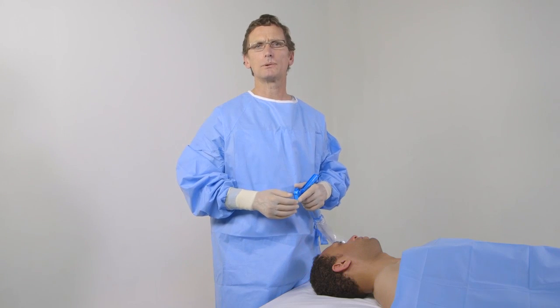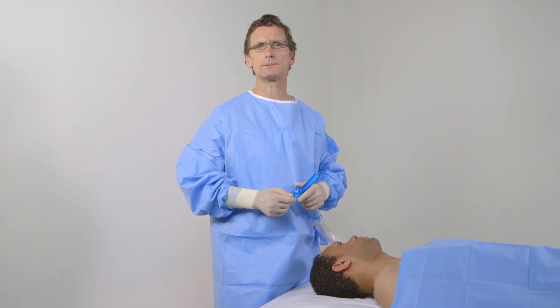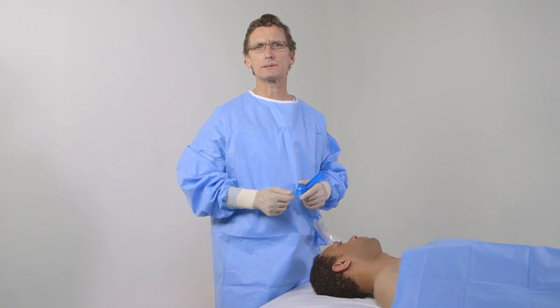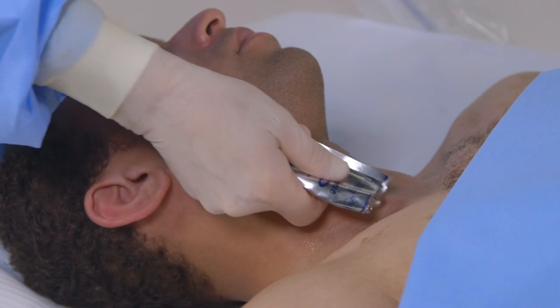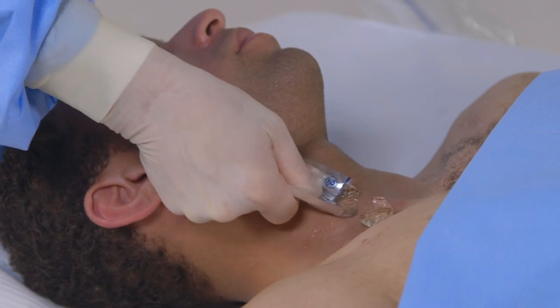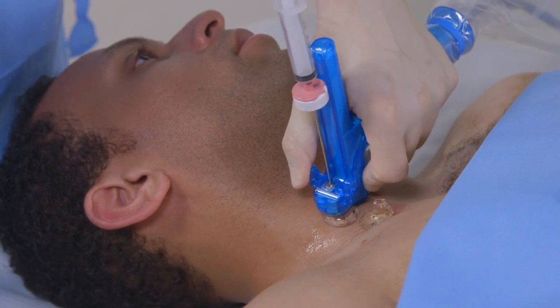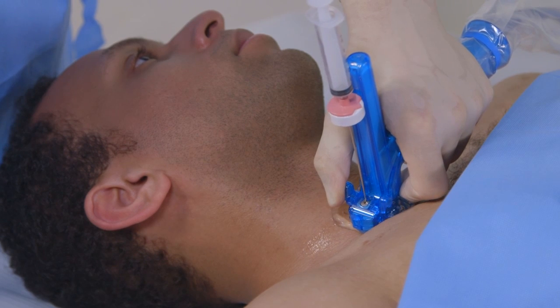I will show you on our model an example of how to perform a supraclavicular central line using AxoTrack. When positioning the patient for this procedure, it is helpful to put a towel roll between the shoulder blades. Place a liberal amount of sterile gel on the probe on the lower neck. Track the internal jugular vein down to the level of the clavicle to a position between the two heads of the sternocleidomastoid muscles.